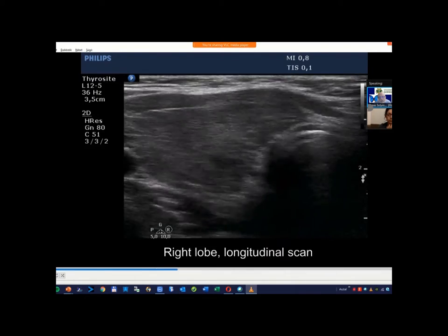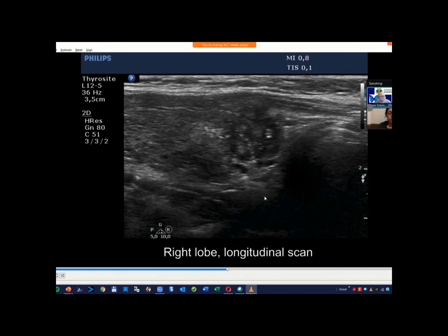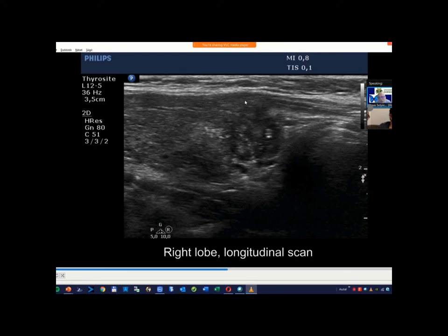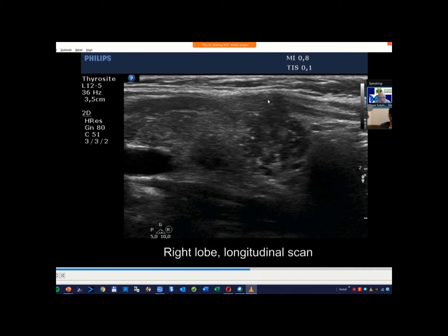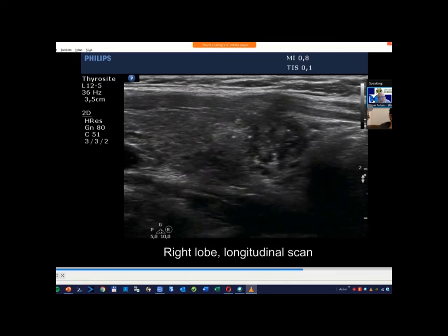Going back to the ventral wall — the usual signs. The capsule is very difficult to interpret, but it is absent here. It does not fulfill the criteria of abutting contour because it must cover at least 25% of the perimeter of the nodule. This small arc does not reach 25%, so by the usual definitions this is not an abutting contour. Bulging is very difficult to judge. It is suspicious that this spreads ventrally, but the almost absolute proof was the vascularity in this case.